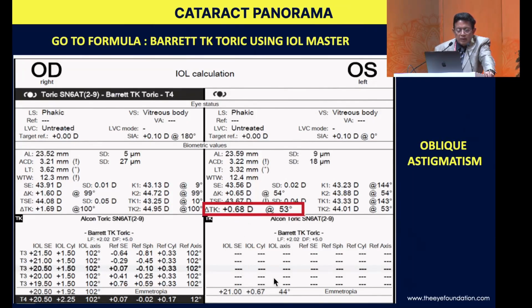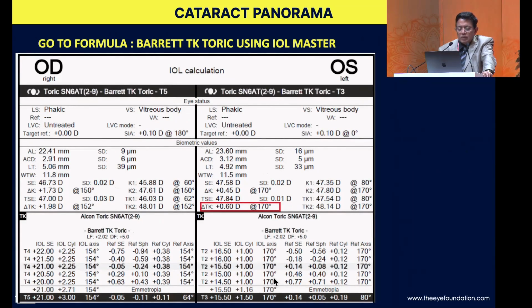So essentially, earlier we used to use the Universal 2 calculator. Patients used to be counseled for multifocals, torics, etc. Then subsequently, when we take them on to the optical biometer, we find that in spite of the astigmatism being just about 0.6 diopters, you need a toric intraocular lens. So oftentimes I'm asked, what is your indication for a toric? What is your cutoff? Is it 0.75 diopters, 1 diopter for putting in a toric intraocular lens?